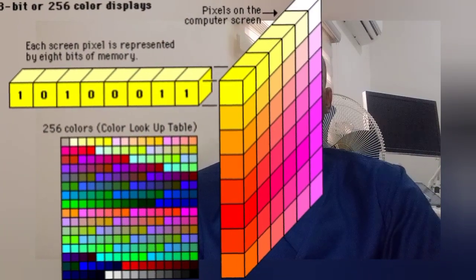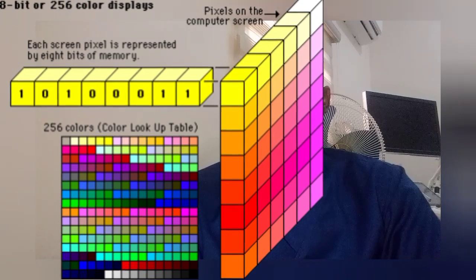Now, since the dynamic range of the echo signal is fairly constant at about 40 decibels, the recent improvements in contrast resolution have occurred due to an increase in the number of shades of gray that the systems are capable of displaying. Now, this is a function of the increase in bit depth of the microprocessor in our modern day computer memories.